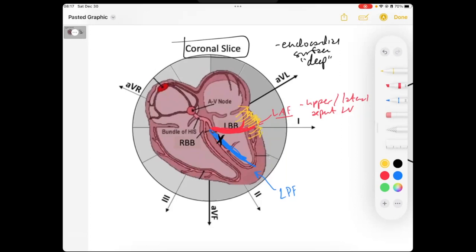And so as you notice, where this is headed to, this is going to produce an R wave in the lateral leads, but it's not going to produce a very large R wave in these lateral leads, lead 1 and AVL. It'll just be a small R wave, because this is only just a small portion of the ventricle. So that's not going to be a very strong amplitude. And so we'll get another small R wave in this lateral lead.